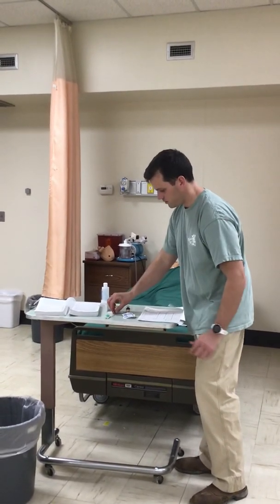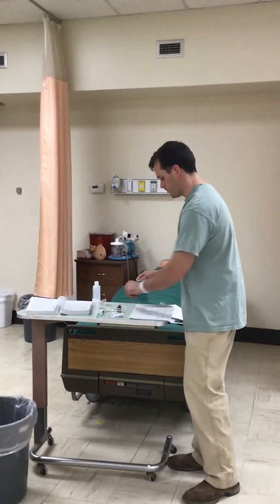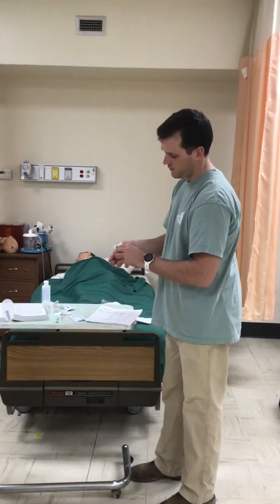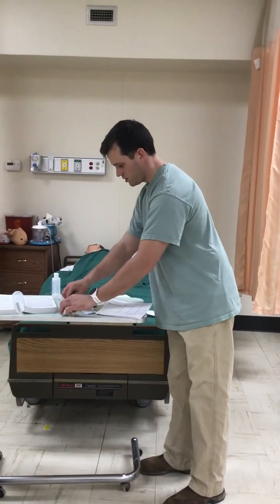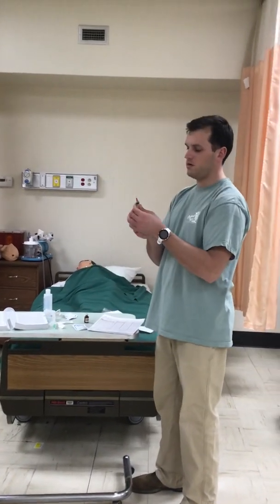Before I do that, I'm going to scrub the top of my furosemide for 15 to 30 seconds. Now, I'm ready. Needle out.